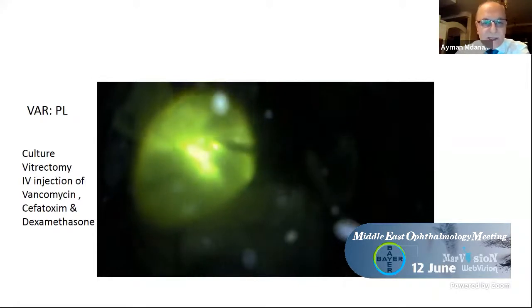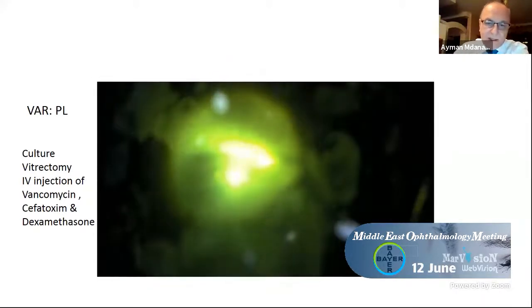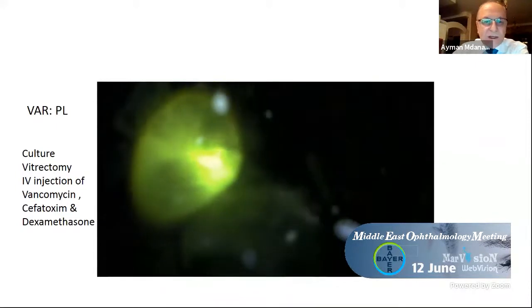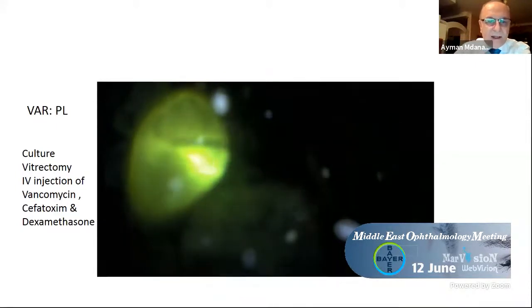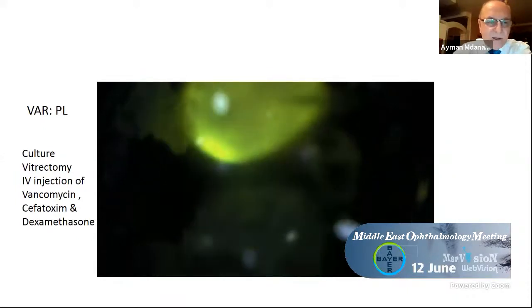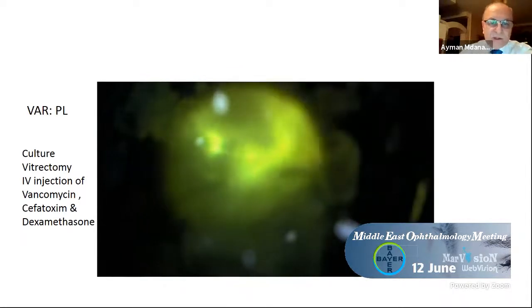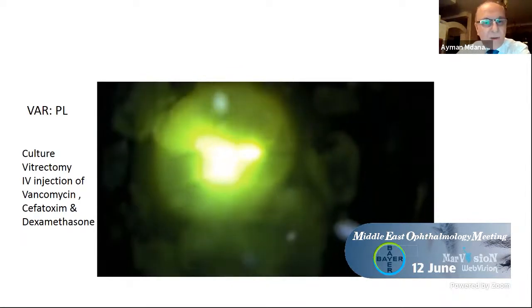So you have in these cases to be patient, try to stay in the middle, try not to injure the retina, because if you injure the retina, if you create breaks, this is the end of the case. The patient will not improve that much. So in these cases, you have to be patient.